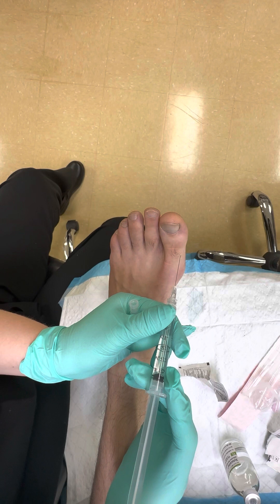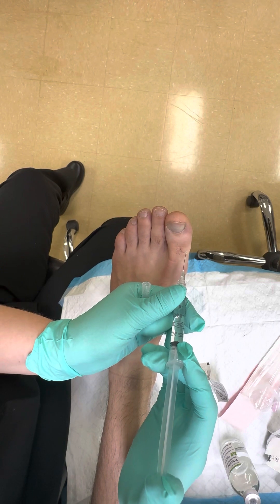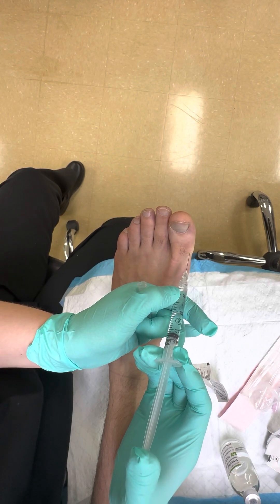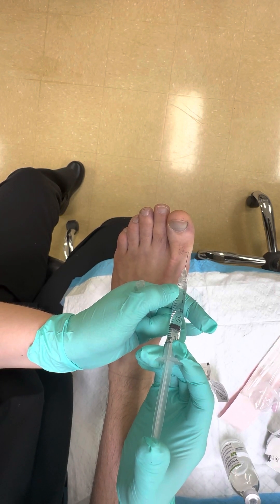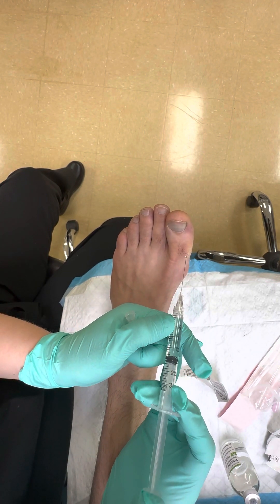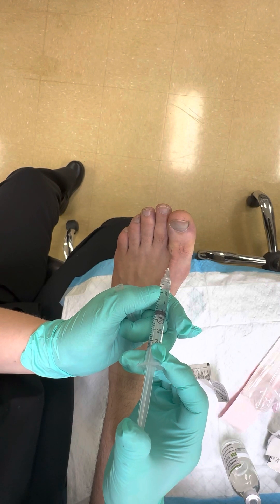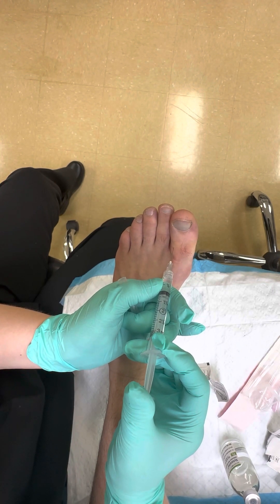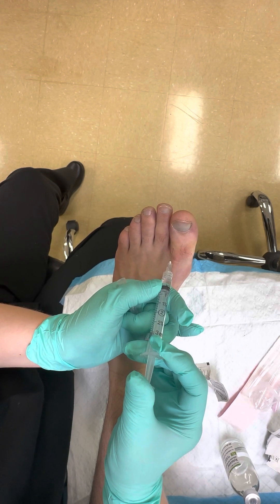Inject in the meaty portion of the hallux — go in dorsally and advance plantarly as you inject, monitoring as you go. Notice the toe is getting a little edematous because the local is filling in. Inject as you pull back out — about 2ml. Go over laterally into that meaty part, inject — see it blanches a little bit — advance plantarly and inject to make sure you get those plantar nerves. This is a one-and-a-half inch needle so you can go a bit deeper into those plantar structures.